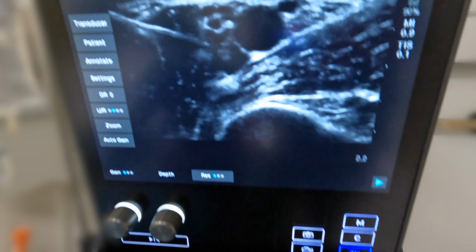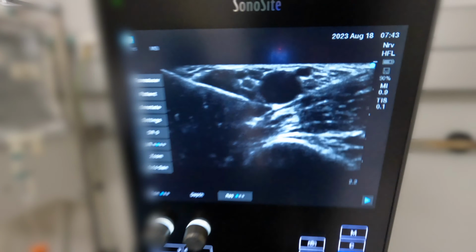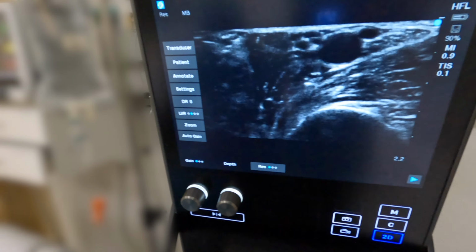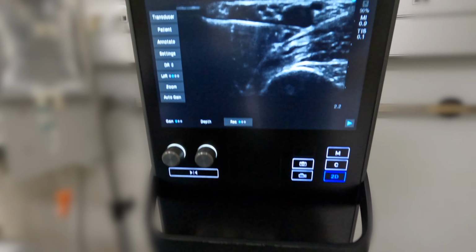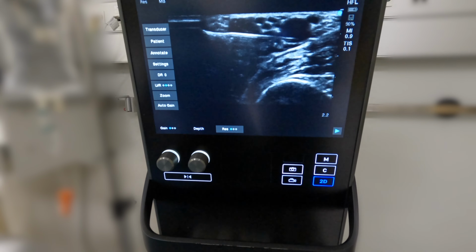Okay, so the spread is in front of the sheath, so that means we really need to get inside. So lift the needle tip up. Yeah. So you want to do this as much as possible. Yeah, I'm doing that. Good, very good. More. Lift the needle tip up more. Advance. Lift it up more. Yeah. Advance. Push, push, push. You'll get a pop there.